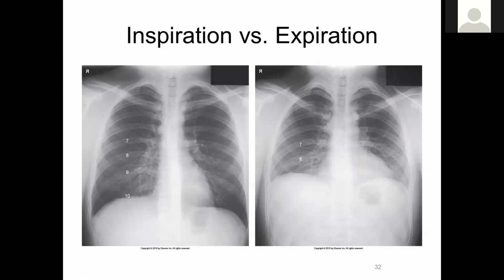You can ask them, did you take a deep breath for that one? No, I didn't. Okay, I need to reshoot this. The diagnostic value is limited if they are not breathing in deeply.